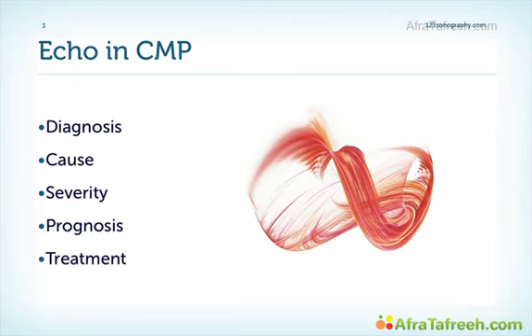When you perform echocardiography in patients with dilated cardiomyopathy, try to put yourself in the driving seat of the referring physician. Try to answer the question as to what is the true diagnosis of the patient? Does he really have dilated cardiomyopathy? What is the cause of the disease? How severely is the patient really affected? What is his prognosis? And can you get clues as to how to treat the patient or how to optimize medical therapy?